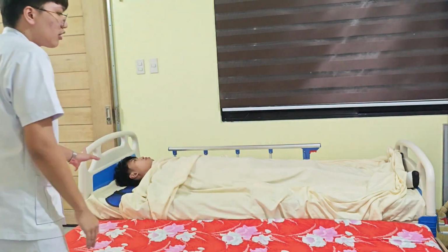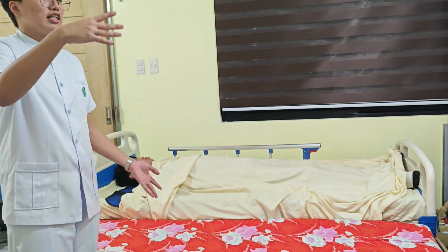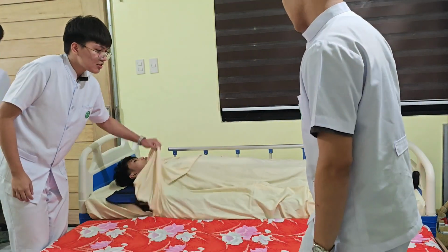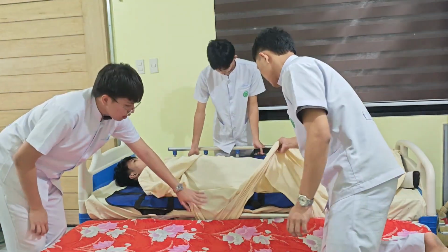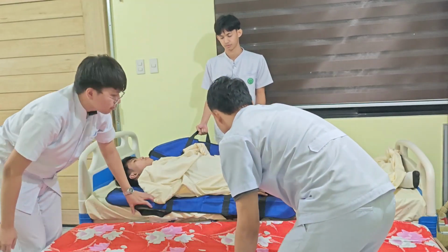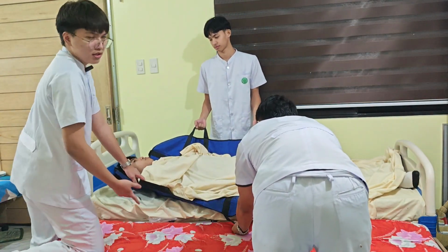After that, we're going to need two assistants from other nurses. So guys, I need help. After having two assistants, one on the other side and two on this side of the stretcher, we're going to count one up to three to pull the patient.